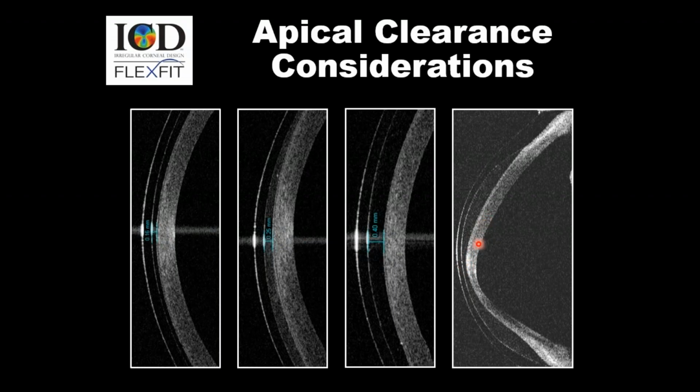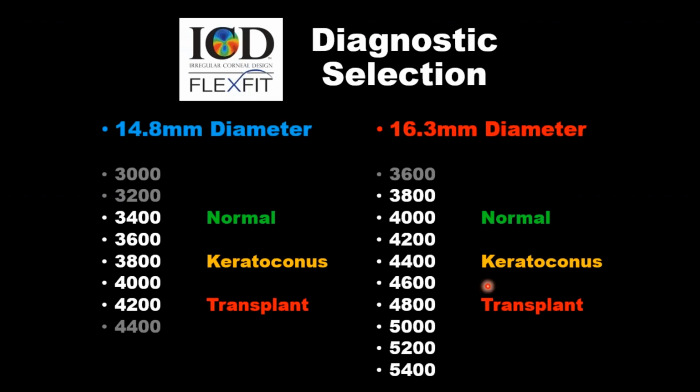This is such a good example where this bulging keratoconic has this incredibly high point here, but in order to clear that high spot, you end up with maybe 900 microns of fluid down here and well over 600 microns up here. So there are cases where we won't get to that target 200 to 300 of post-settling fluid. You may need to create more to ensure that you're protecting that diseased tissue.